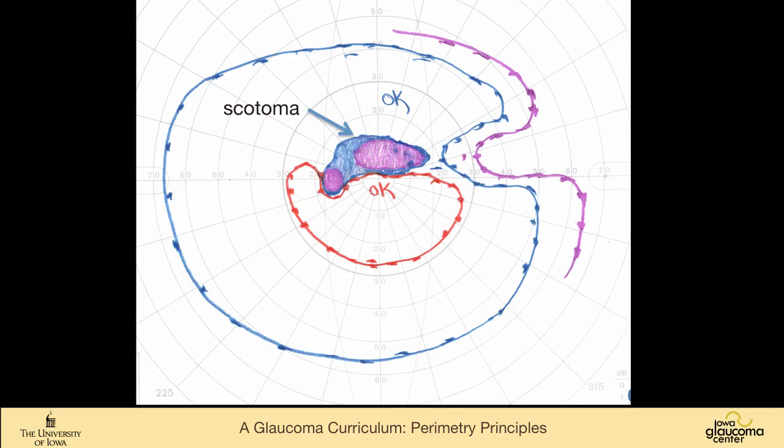This is a patient with glaucoma with a dense arcuate scotoma that is just splitting through fixation, and also a nasal step out here. You can see that, again, the 1-4E and 1-2E look pretty full, just like that normal field out temporally, but nasally there's this big dent in the field. And so the perimetrists use the 5-4E, the brightest, biggest target, to characterize that. Manual kinetic perimetry is very much an art form, and so it takes years to become a great perimetrist. And unfortunately, it's a dying art form.